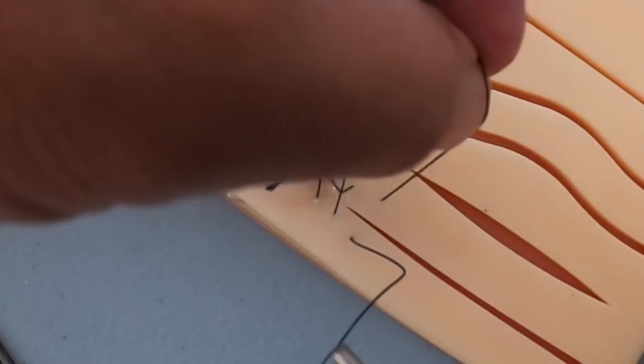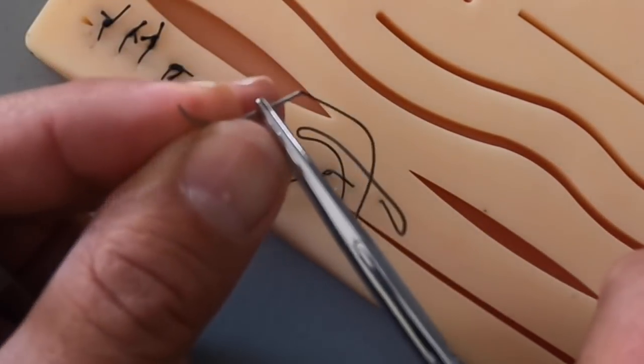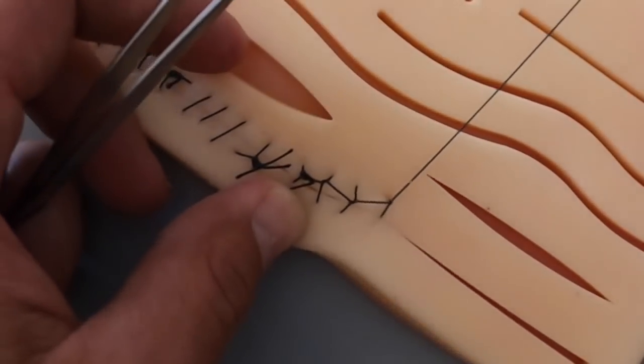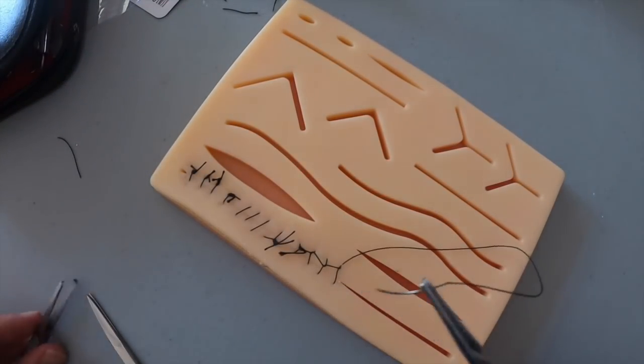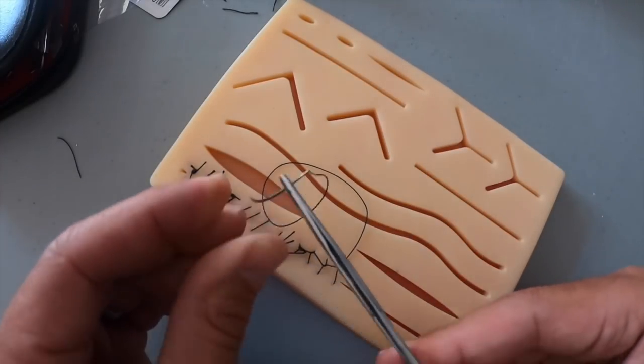And then you got your loop, pull it through the loop before you pull back. Now I could keep going and going and going the whole length of the laceration, but what we're going to do is stop right there and do our last one because I didn't have a long thread for this laceration repair.